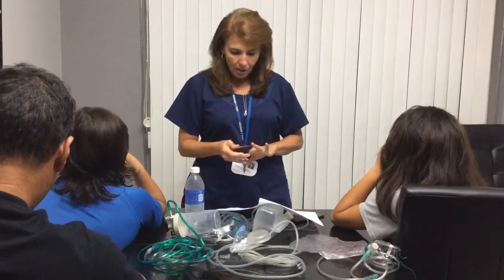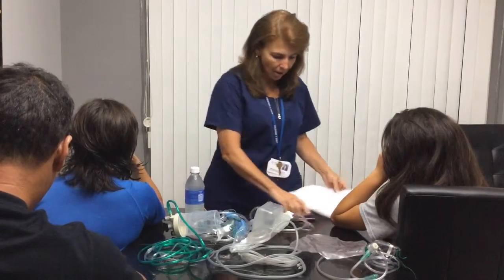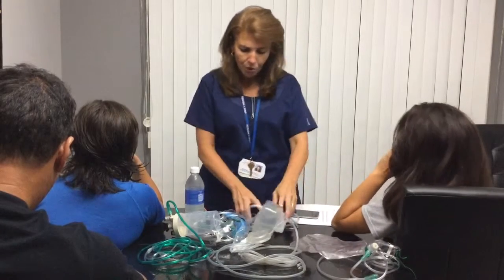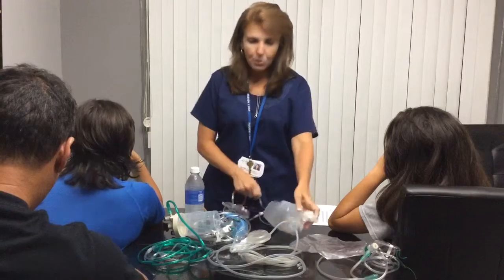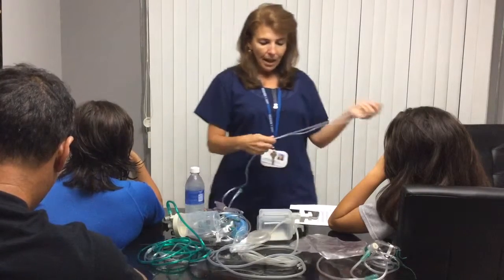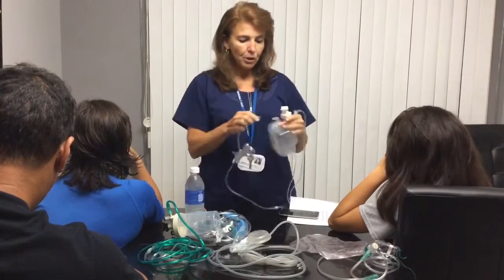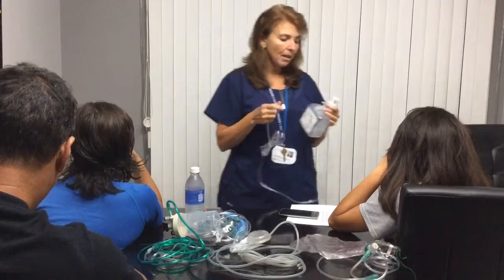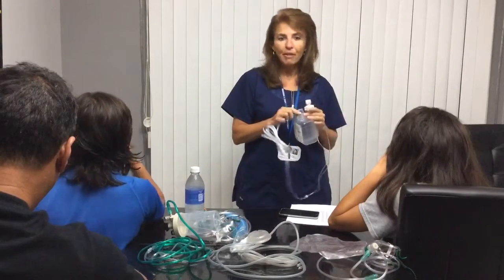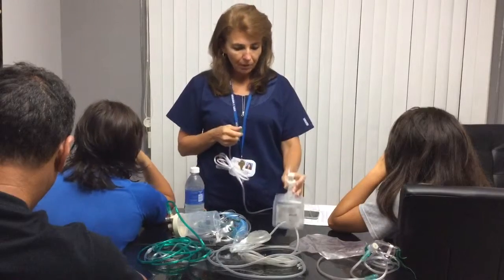So moving on to oxygen therapy, we're going to look at some basic oxygen equipment. We'll start out first with your nasal cannula. Nasal cannula flows 1 to 6 liters. After 4 liters, we would want to humidify the oxygen. It can be very dry. If the patient has bleeding or dry nares, or any patient complaints, we can humidify at any level, though our policy does state after 4 liters we would humidify.